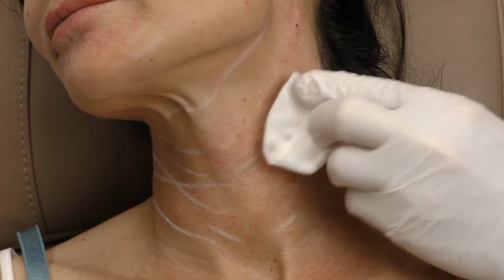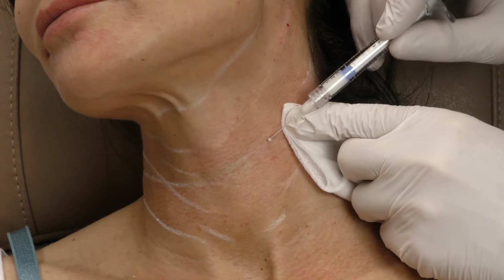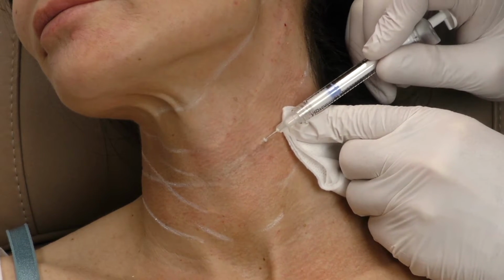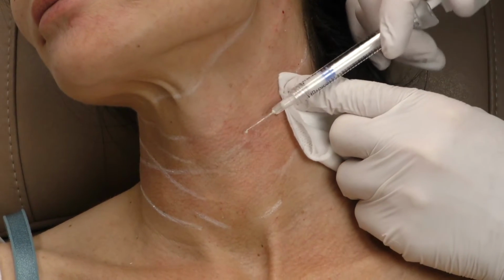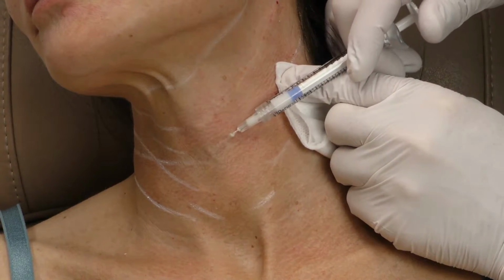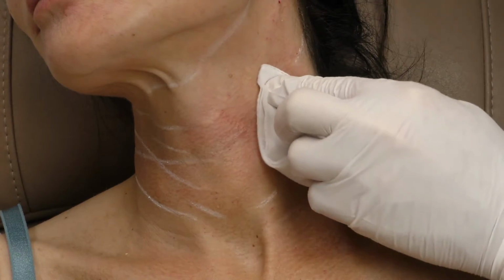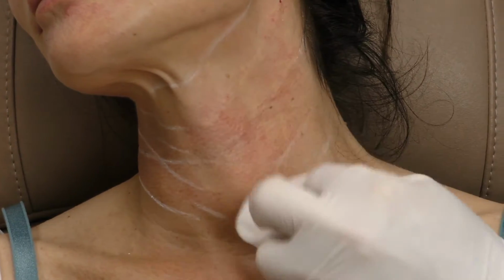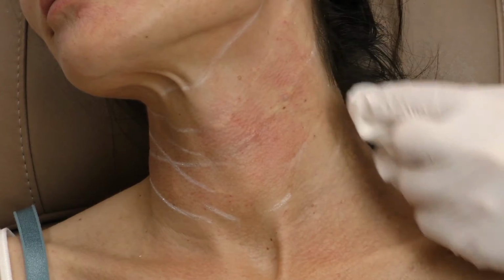That would be a different story if I would inject the non-diluted product. That would probably stay in its place and result in, let's say, very visible sausages, visible depositions of retrograde linear threads. So therefore, it makes sense to use this 50-50 dilution.